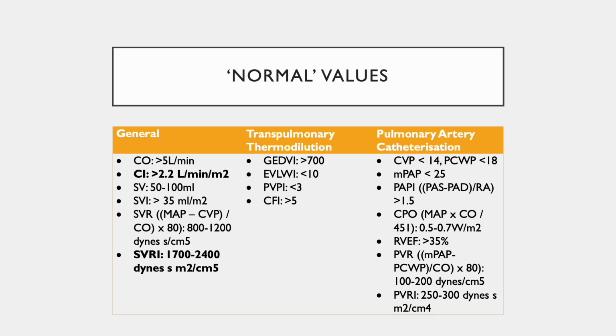Conversely, a patient with an ongoing acute myocardial infarction going into cardiogenic shock with a similar hemodynamic picture actually requires urgent resuscitation and hemodynamic support. As such, these values serve only as a ballpark reference to guide overall management, but importantly have to be contextualized to the patient's overall clinical state.